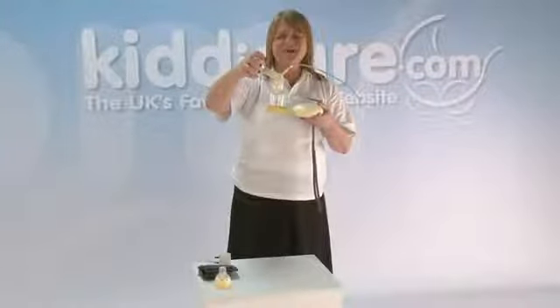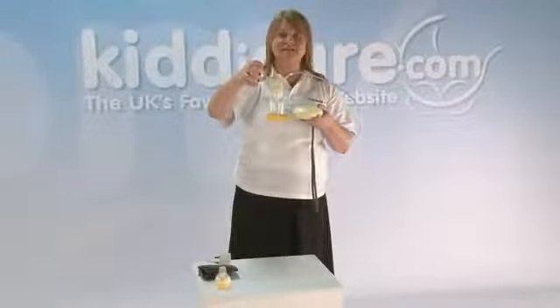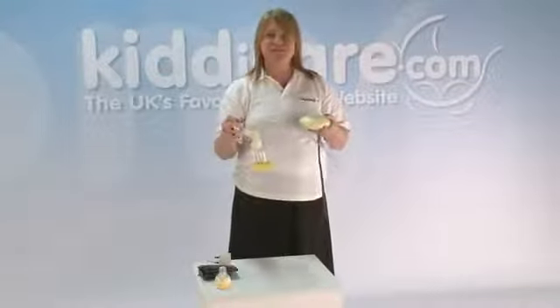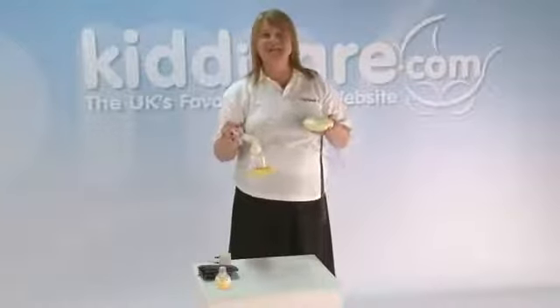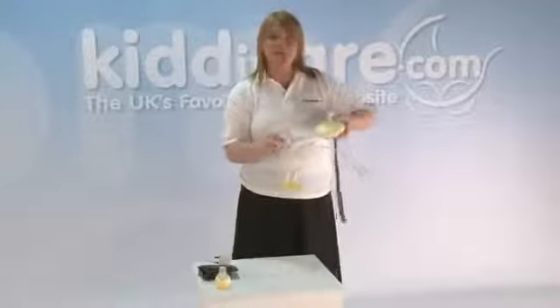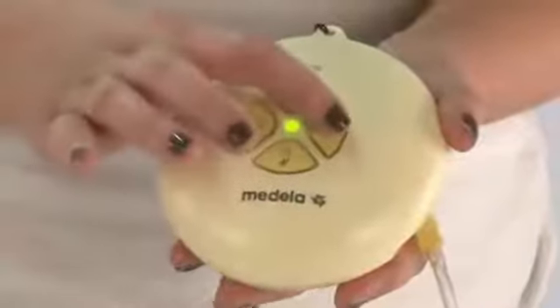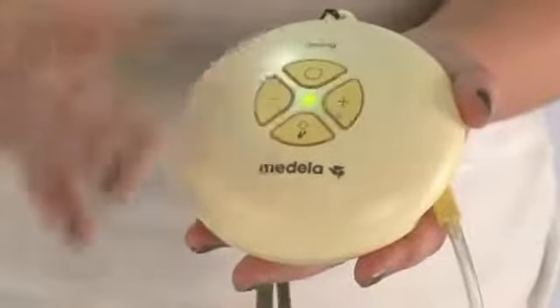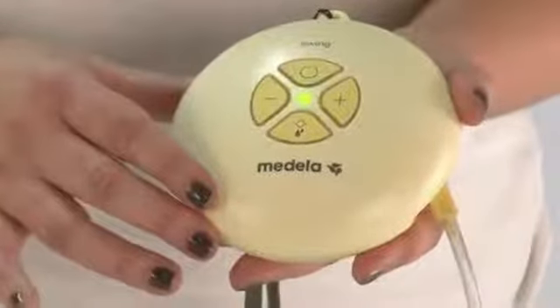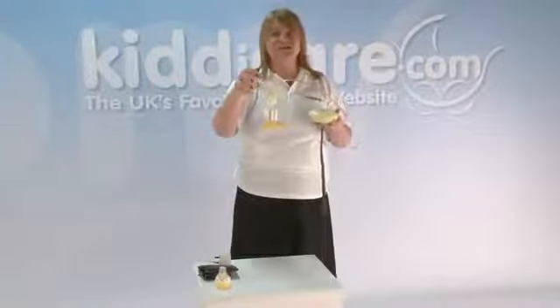On the pump, these sucks are about 2 per second, and the pump will do these rapid sucks for 2 minutes. Mum can't change the speed on our pump because it's based on how babies do it. The only thing mum needs to alter for herself is the vacuum, and that's really important because it's individual to every mum. The way we change it is with the plus and the minus. So, to judge it, you turn it up until there's slight discomfort. Don't leave it there, then turn it back 1 or 2 with the minus. After the 2 minutes, the pump will slow down to the second part, which is the expression phase.